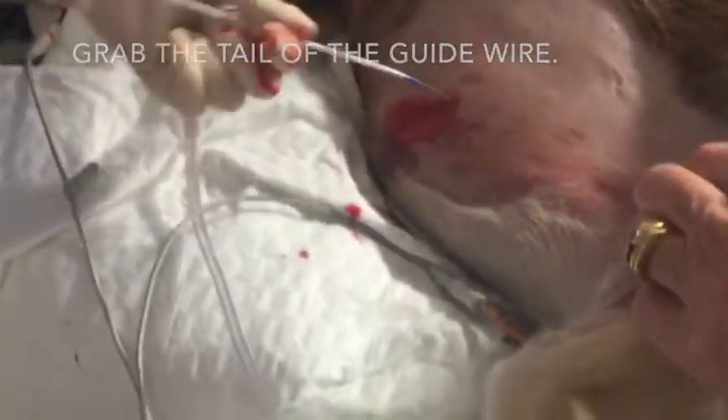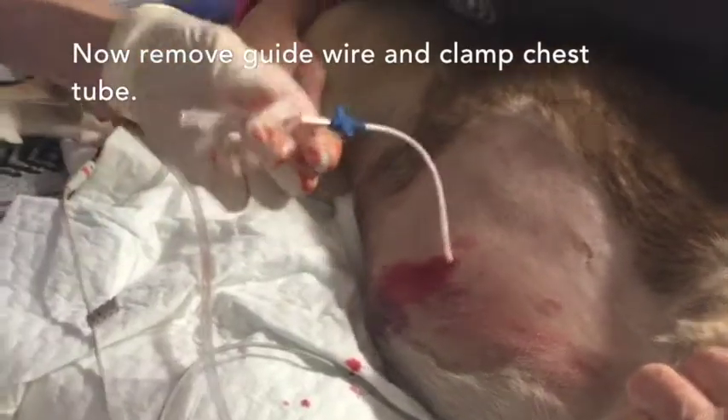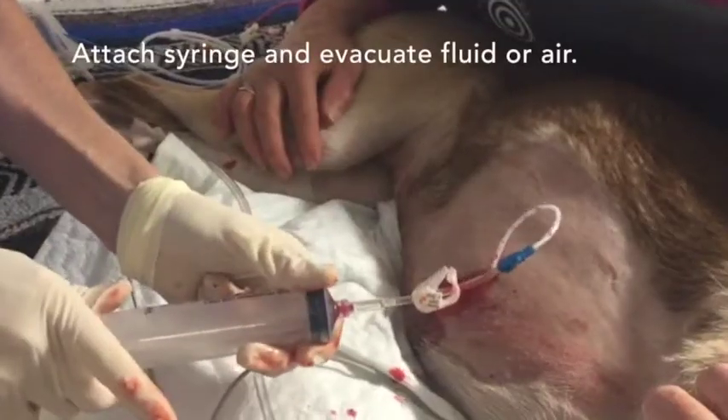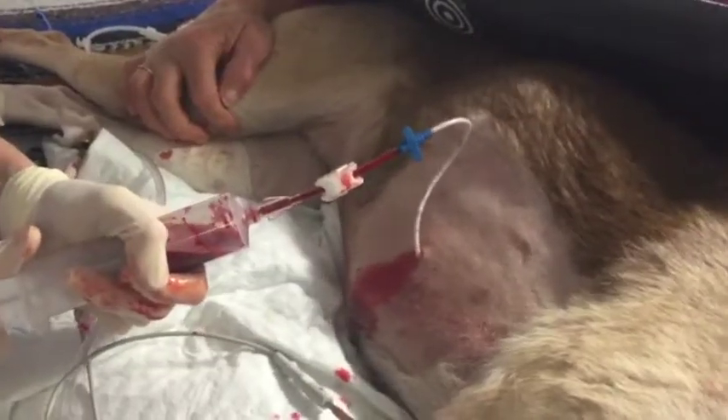Advance the chest tube to the desired depth, then remove the guide wire and clamp the chest tube. Attach a syringe to evacuate fluid and air. Secure the chest tube in place using the suture wings provided.